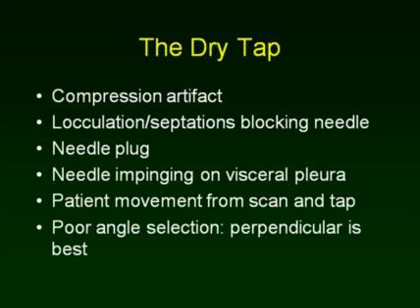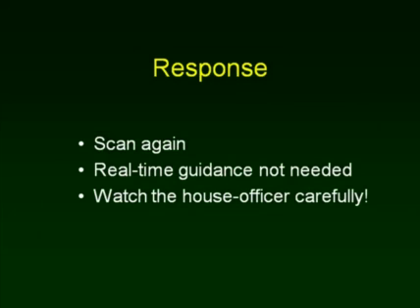If possible, it's best to have a final angle of attack that's perpendicular to the skin surface, because that's very easy to duplicate with the needle assembly. What's the response? Scan again. Real-time guidance is generally not needed, but always watch the house officer very, very carefully.